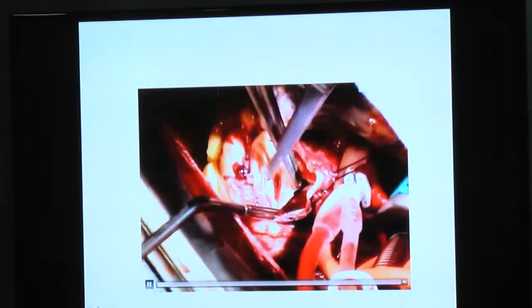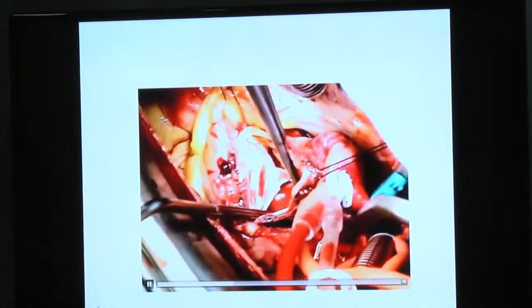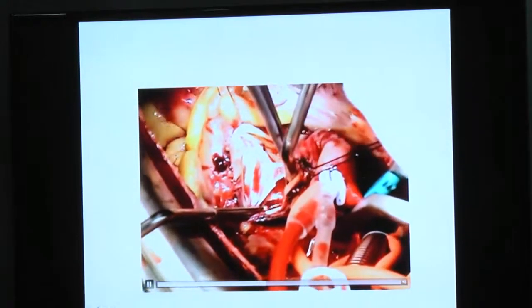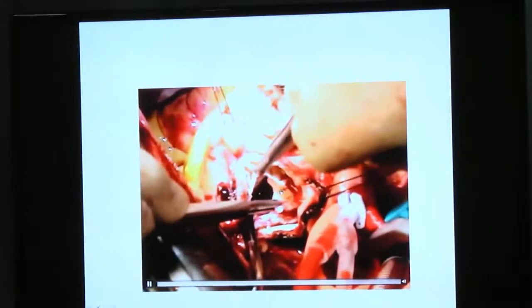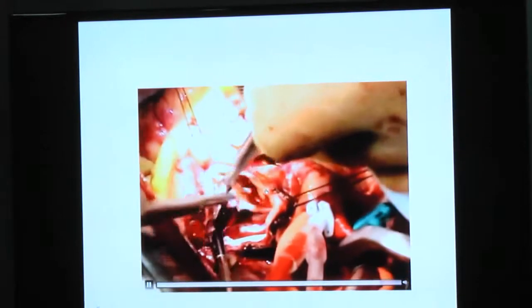And when this patient was taken up for surgery, you can see the whole of the non-coronary cusp is torn. You can see this is the region of the valve which was torn there. You can make out very clearly that because of the fall he had, the whole of the cusp was torn basically. There is a torn valve, what you can make out. You can see it better now. You can see the whole of the right coronary cusp as well as the non-coronary cusp being torn, and you are having a region. You can see the flail here. That was the reason for the AR.